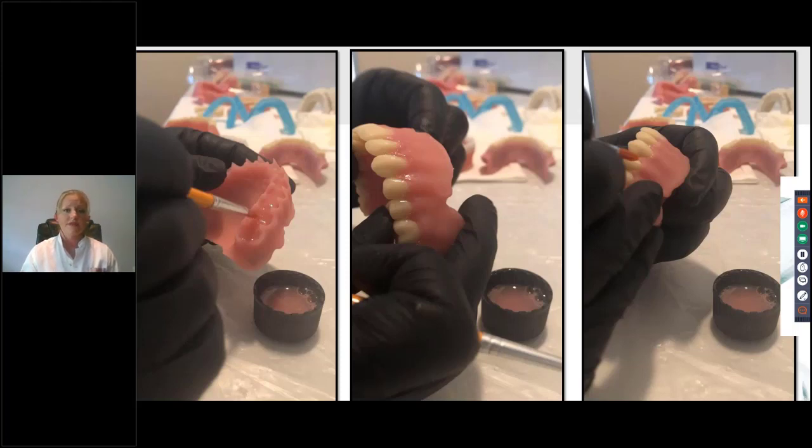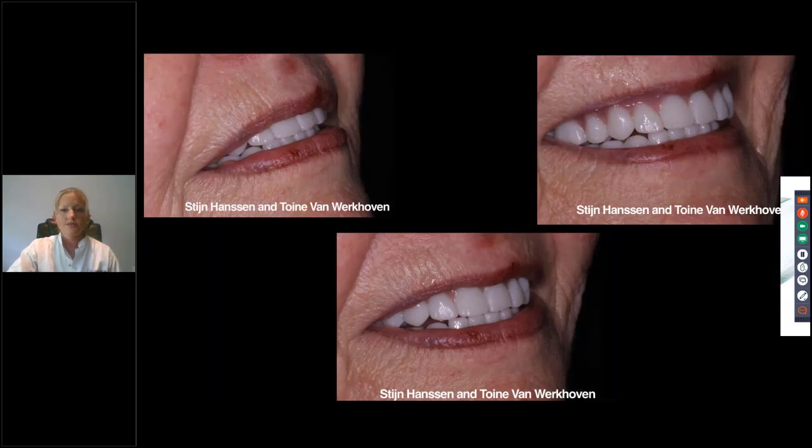I'm going to show you why it comes out with such a nice texture out of the NextDent printer in a little while. You can see on this middle picture here just a tiny part of that support. That's as small as those things are. You can just snap them right off with your thumb while you're cleaning the prints. So I'll show you that as well. And there's one in the mouth.